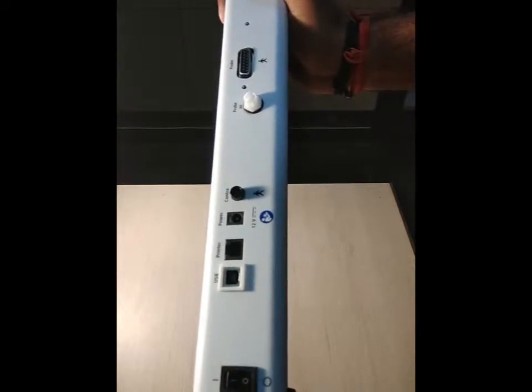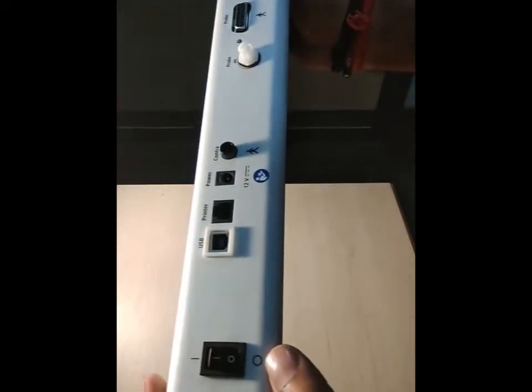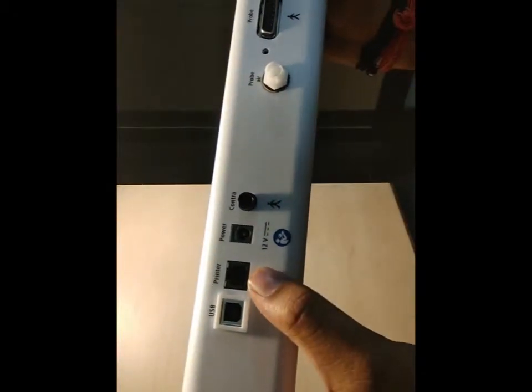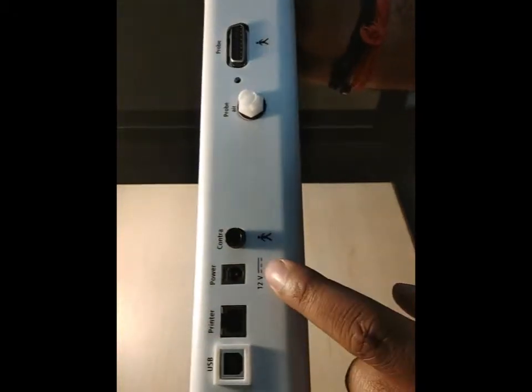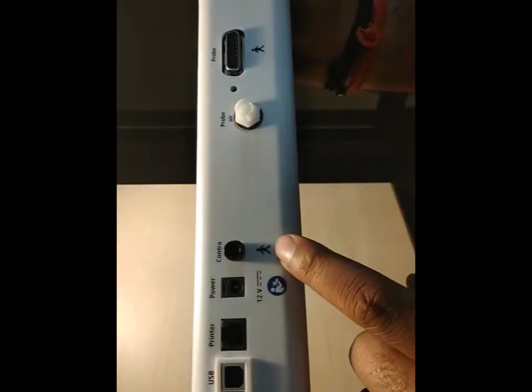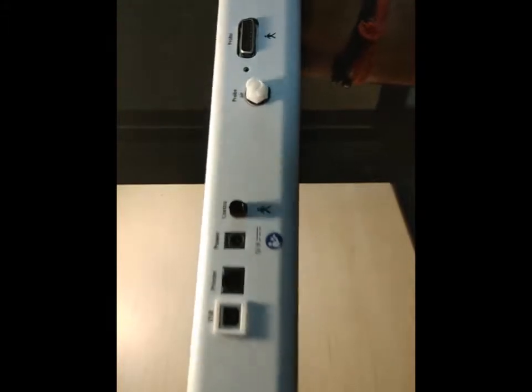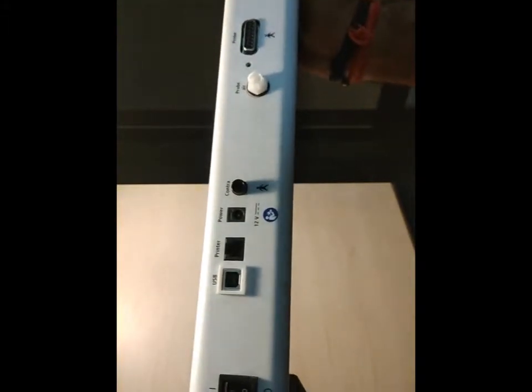This is how the back panel looks. This is the on/off switch, this is the USB port, printer port, and power adapter point. This is the contra headset port, and this place is for the probe. It's quite neat.